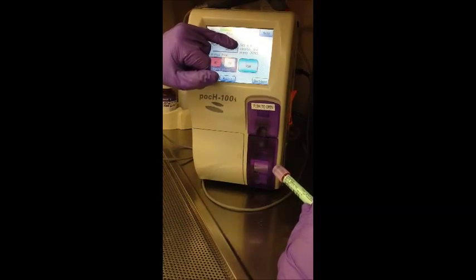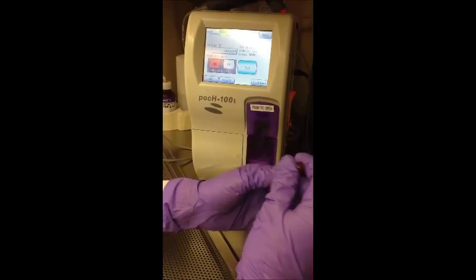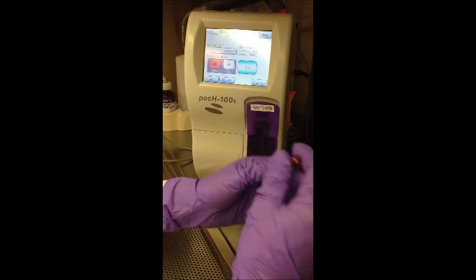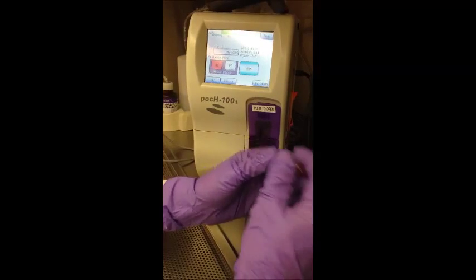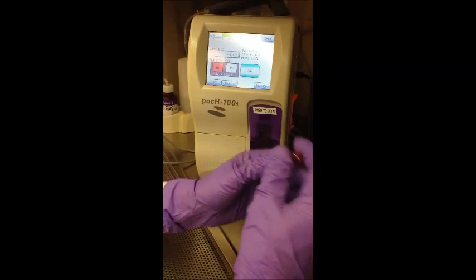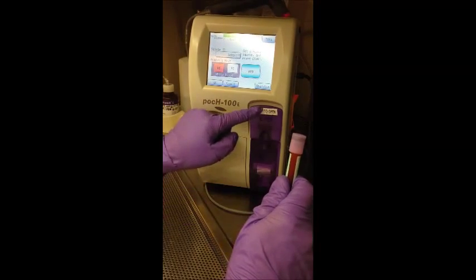Set a mixed sample and press run. Mix the sample. Keep the sample top on.